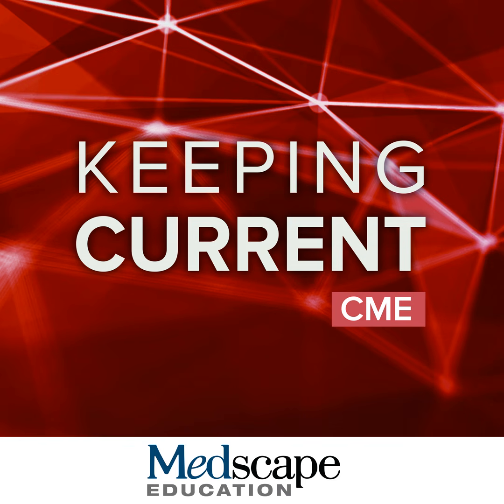Now, the validation for these amyloid PET tracers actually did come from autopsy studies. So we had 29 patients in the original florbetapir autopsy study where patients actually were enrolled from hospice and agreed to get a PET scan while they were still alive and then to donate their brain to science for that validation. And what was identified was that there was an agreement between the visual read on the PET scan and the autopsy in 96% of the cases.